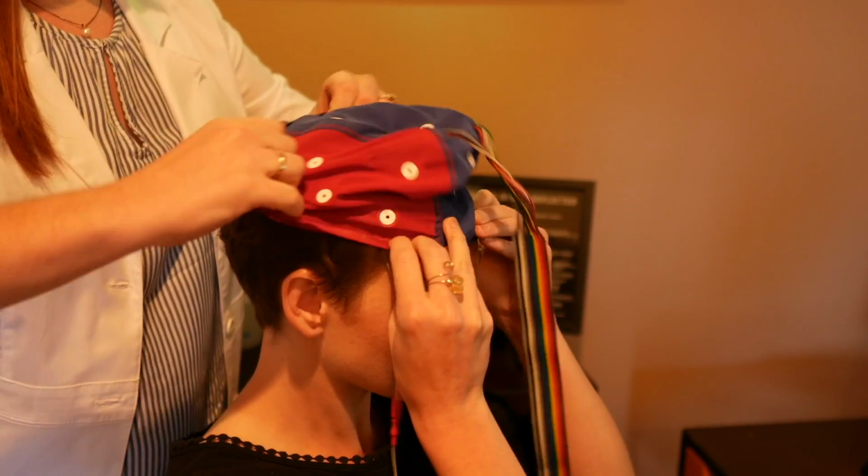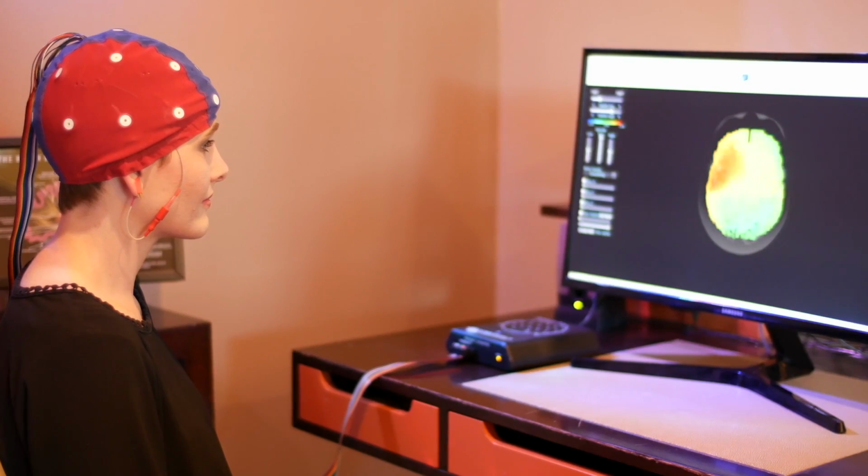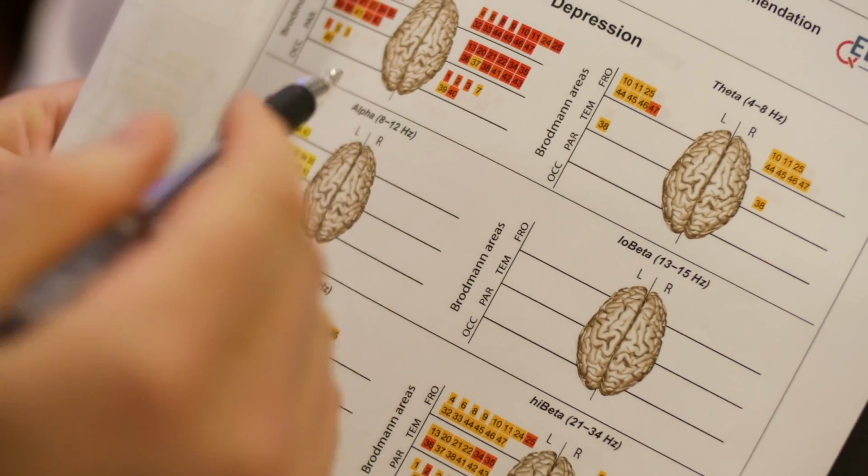There's lots of times people have come into my office, we do a QEEG, and I say, I wouldn't do it. Not based off of this. It's in the norm. So you might get someone like that that's like, hey, it's not worth it. It's not that far outside of the norm. Probably not going to notice a difference. There's times you can use standardized protocols, however, so talk with your provider, but that's what to expect.